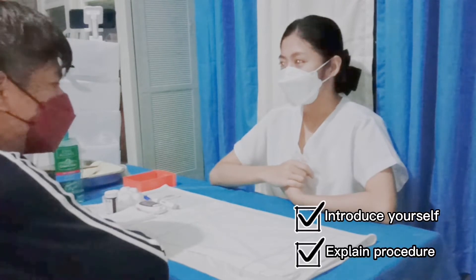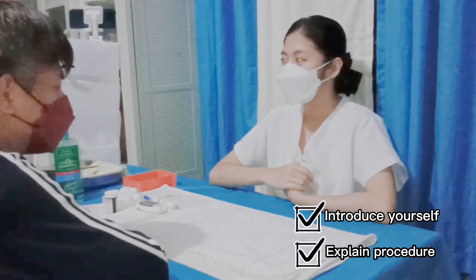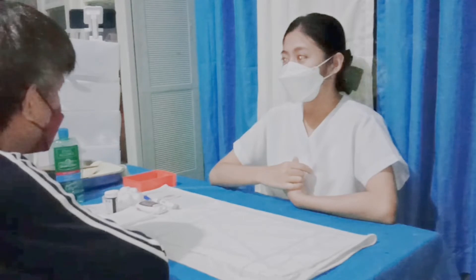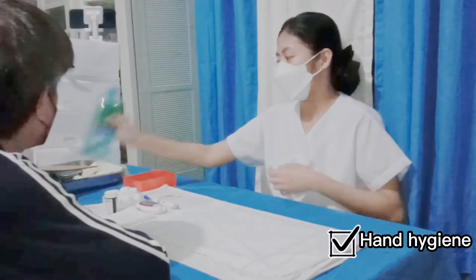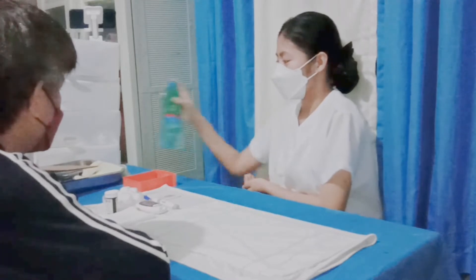Today, sir, I'll be performing a capillary blood glucose test. This test is done in order for us to determine and identify your blood glucose level. Sir, this procedure will require me to prick your finger. Will that be okay? Okay. Don't worry because I already washed my hands and I'll perform another hand hygiene in order to prevent spread of microorganisms.